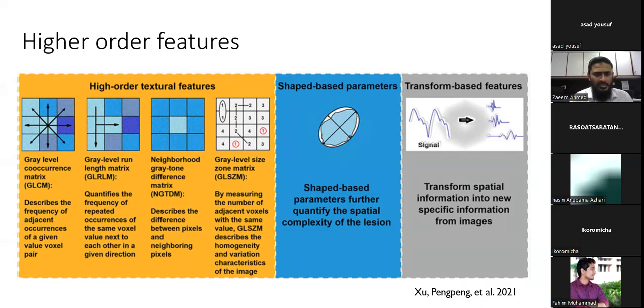So these radiomic features are basically calculating the randomness, homogeneity, non-homogeneity, or any sort of texture correlation between pixels occurring in the selected feature. So that's the quantities which radiomic features are measuring.